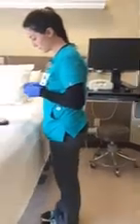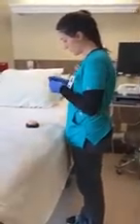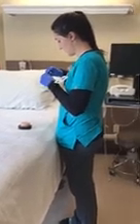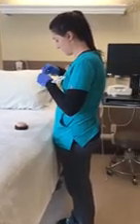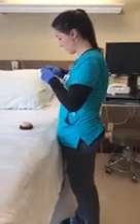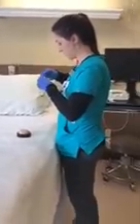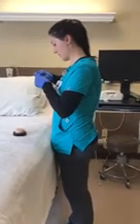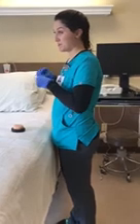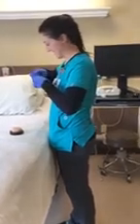Okay. This is a lovely needle. Since it's not threaded, I would typically use a threaded needle if I had one.